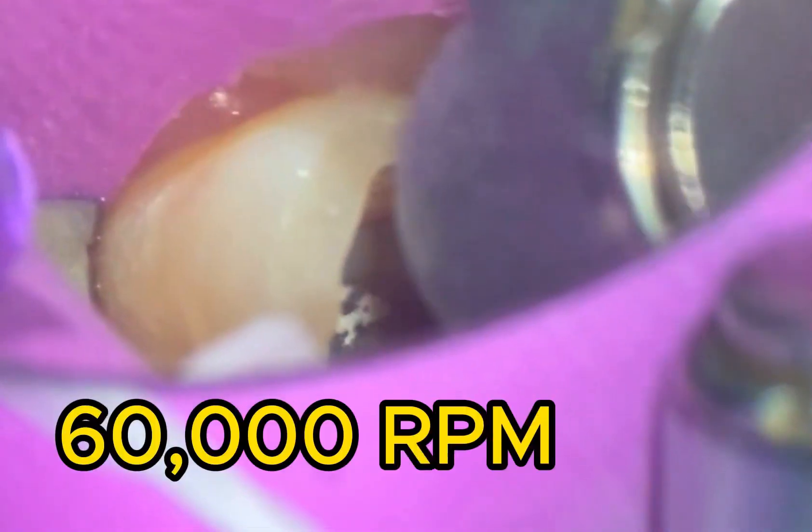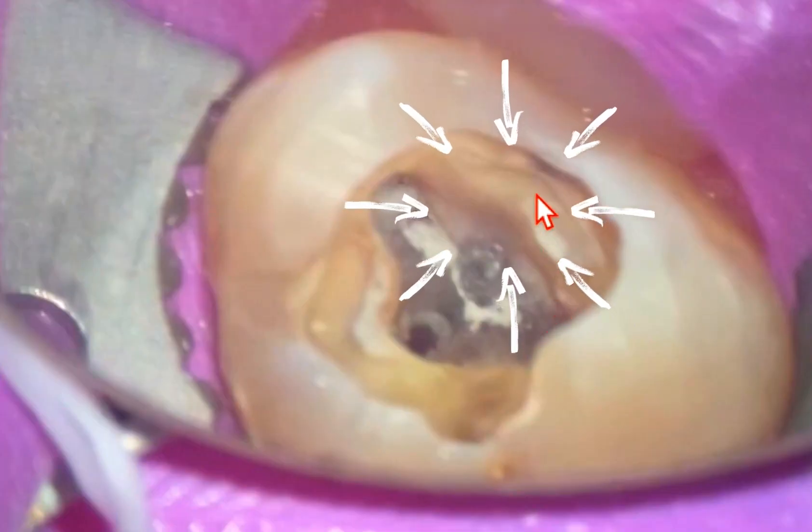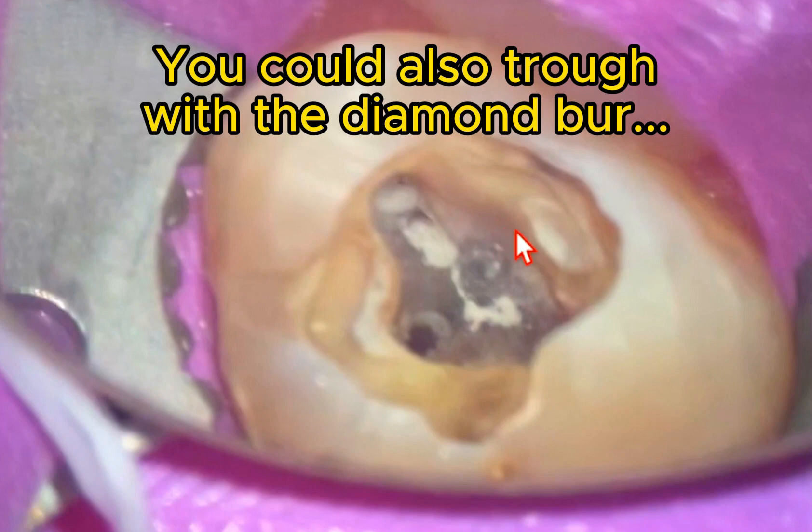It's easier, honestly, to take the long shank diamond bur. This is an electric handpiece — we're going to run it at around 60,000 RPM — and we're just going to smooth that mesial wall. What we've done is taken a little bit of dentin away and smoothed the path for that MUNSPRO to get in there, making life so much easier. Now you can see it's a smooth path and it's easy to get the MUNSPRO in there — I'm using the purple MUNSPRO.